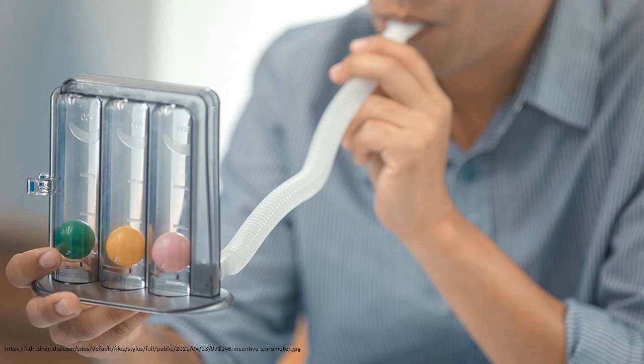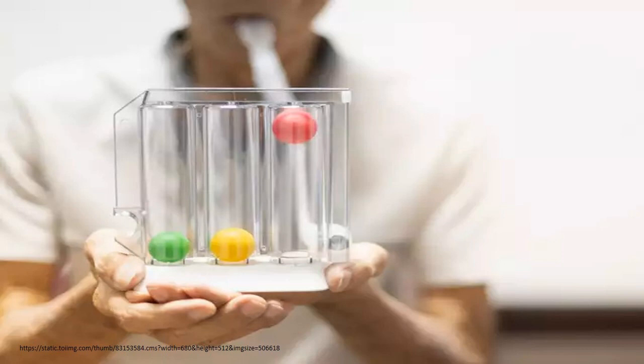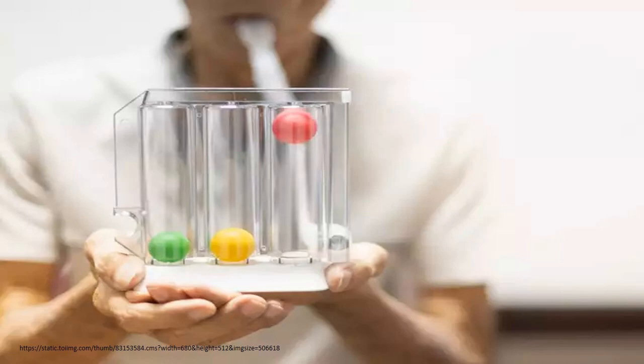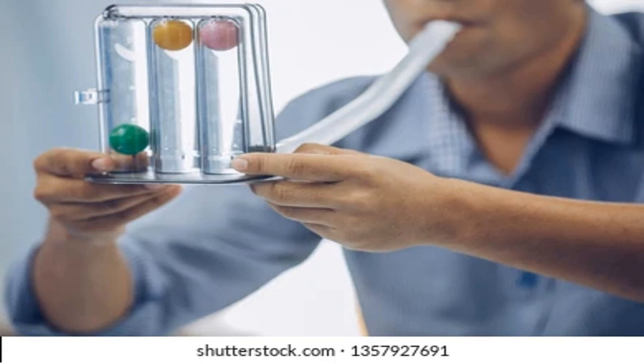Using the mouthpiece, the patient breathes in from the device as slowly and deeply as possible, then holds that breath for two to six seconds. This provides back pressure that pops open the alveoli — the same effect as that which occurs during yawning. An indicator driven by the patient's breathing provides a gauge of how well the lungs are functioning by indicating the sustained inhalation vacuum. Patients are encouraged to do many repetitions in a day, measuring progress by advancing the movable gauge along the central column of the device.